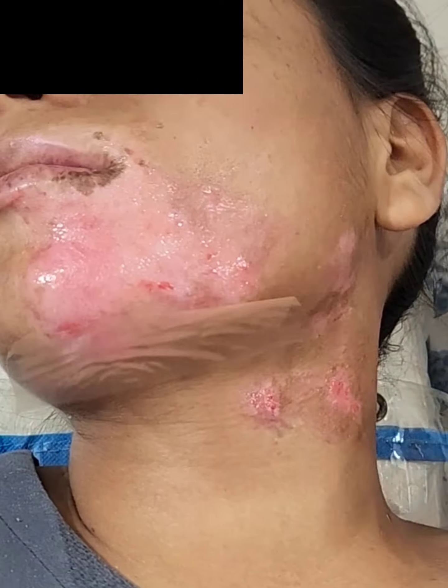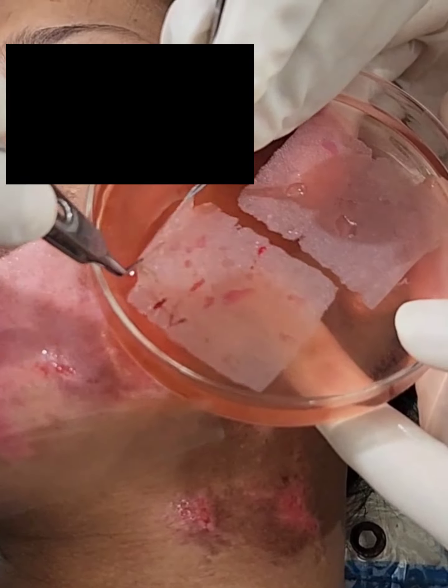the graft was taken from the lateral aspect of the thigh. A very thin graft was taken and trypsinized.